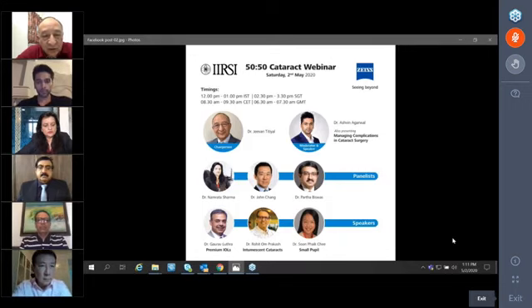So what I would appreciate the younger generation to make sure, if you have loose zonules or a disease process like degenerative conditions, maybe with the knowledge of having good results with fixations, the primary surgery can be fixation in such cases, so that we don't have to have a second procedure like this, because these procedures are not free of difficulties or complications.